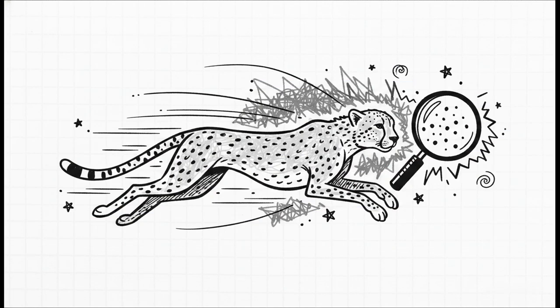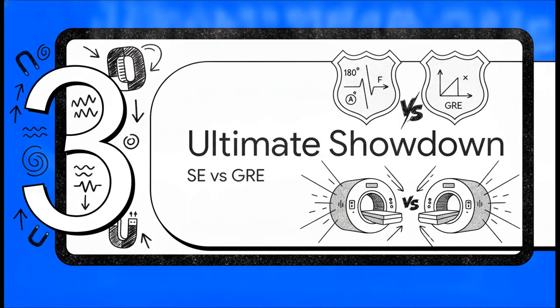But, and it's a big but, because it doesn't actually flip the spins, it cannot correct for local magnetic field imperfections. It's highly sensitive to its environment, making it incredibly prone to susceptibility artifacts from things like iron or air tissue borders. Section 3. The ultimate showdown.